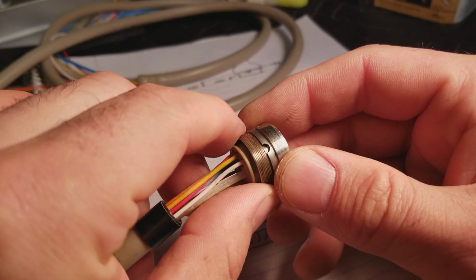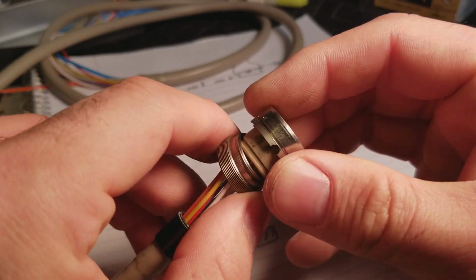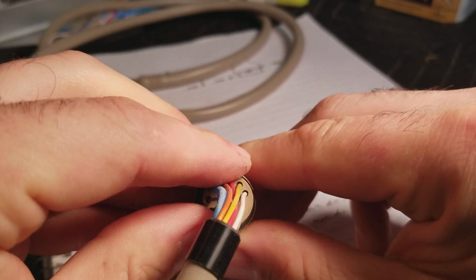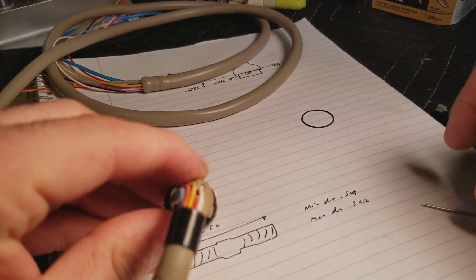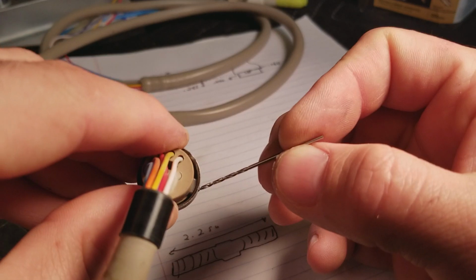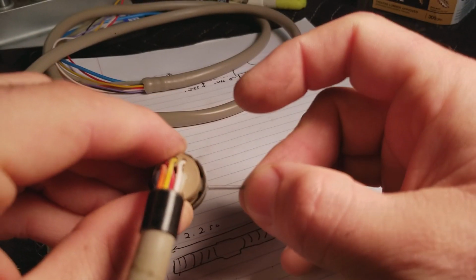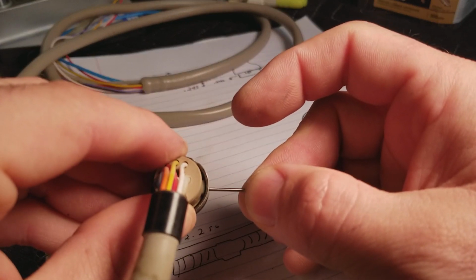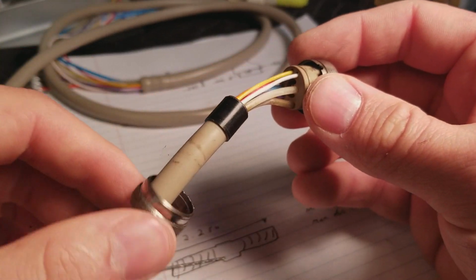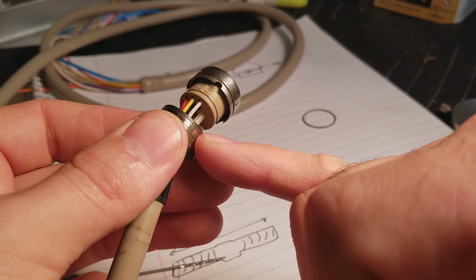If you happen to actually pull this piece out like this, you'll find it's very difficult to put it back in place. There actually happens to be one spring-loaded component here that does the action to push out all the little balls. You can see it right in there. That's the one right there. To get this back together, simply push in on this little ball, and you'll see it pushes that block back in place to help be able to seat this thing back in there so those balls can run around on that race.